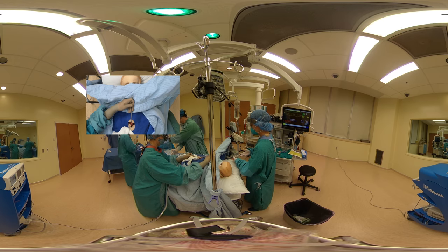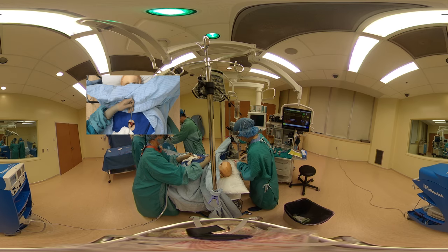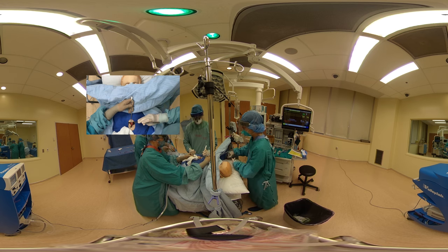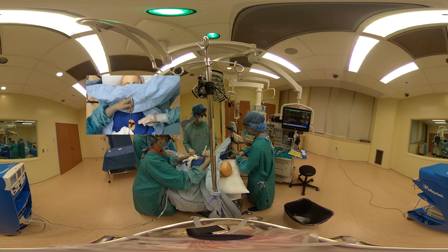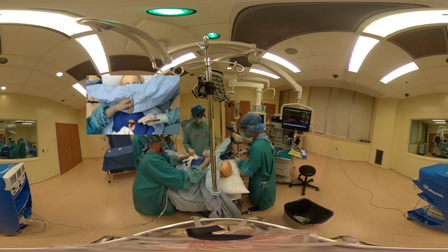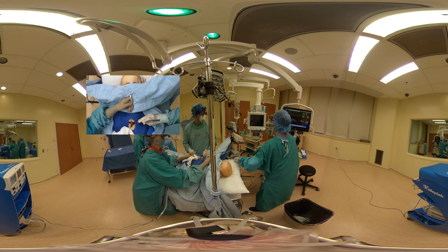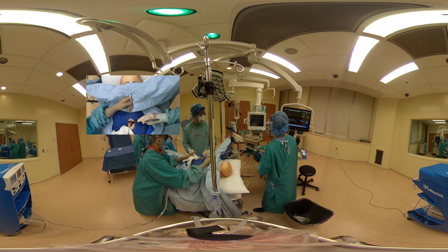I'm going to induce anesthesia now. John, we're going to put you off to sleep now. Take some nice big breaths for me in and out. We'll take good care of you. So I'm doing a rapid sequence. Propofol is in. 100 milligrams of rocuronium is in. I'm going to turn on my twitch monitor. Let me know when he's paralyzed and you can proceed with the tracheotomy window. I'm waiting 60 seconds.